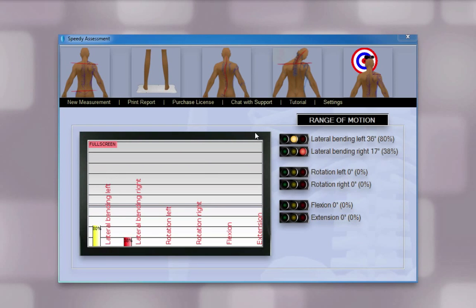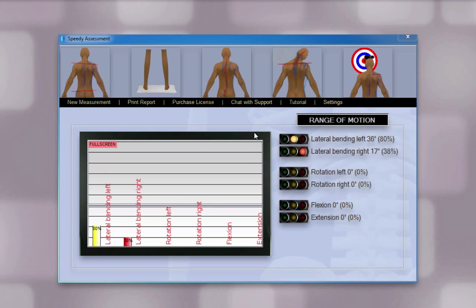Here you see the results. The traffic lights indicate green for good, and yellow or red indicate a need for further examination, as do the colors of the bar graphs. Your webcam needs to be direct show compatible. We recommend the Logitech 9000 Pro as it provides superior quality.